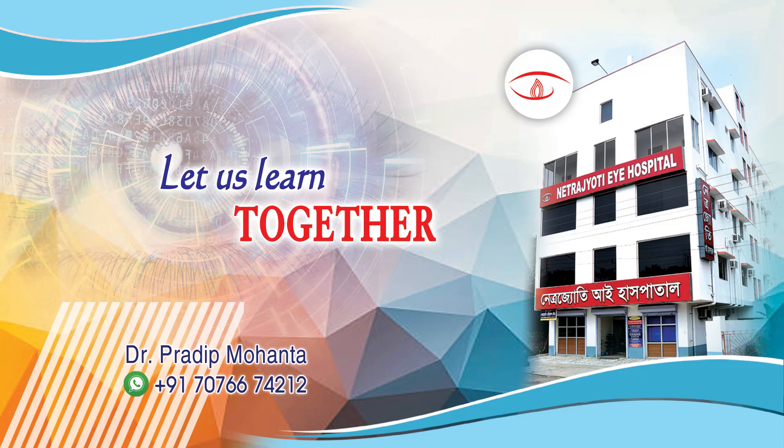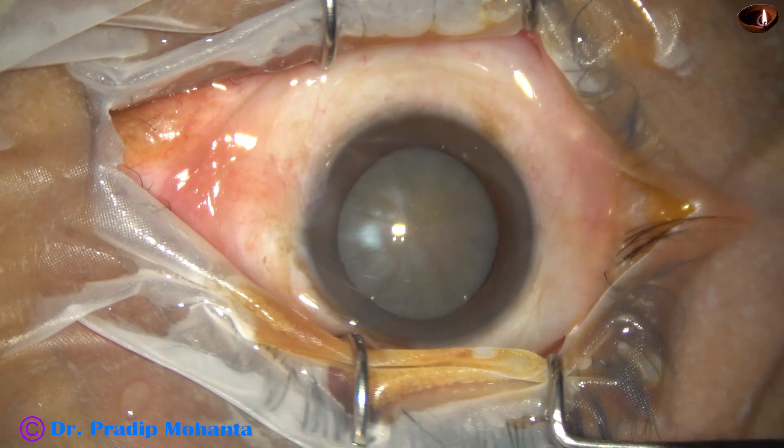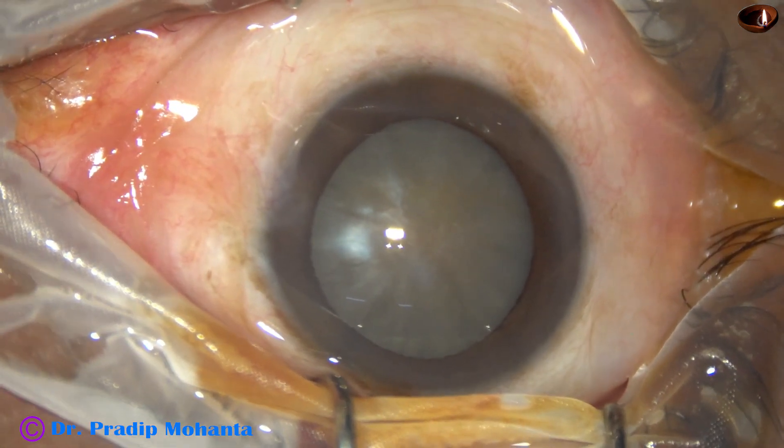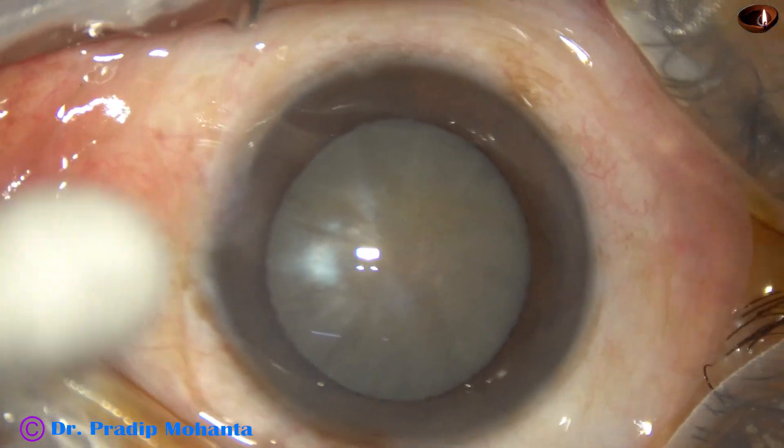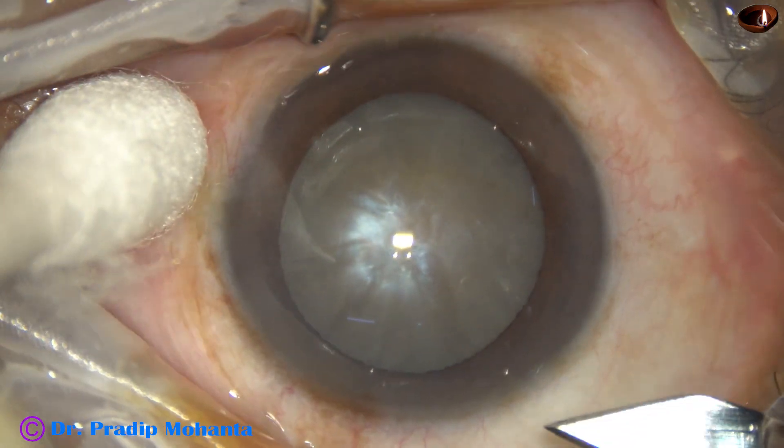Welcome to my workpiece at Ranaq Heartist, Bengal, India. This is a totally unedited video. This is an intumescent cataract and I am going to demonstrate each and every step in real time.